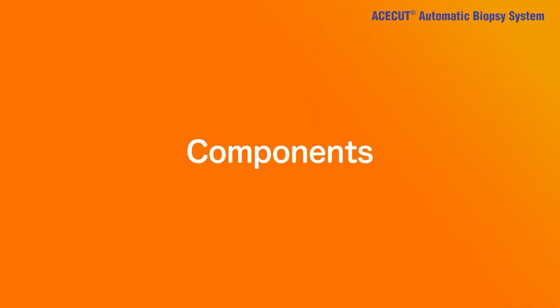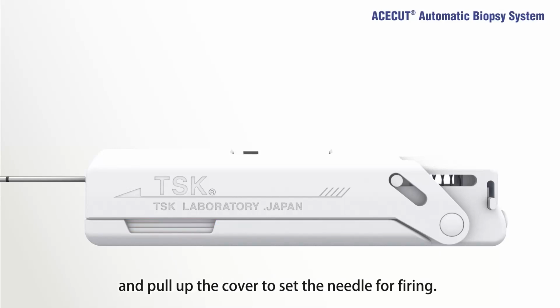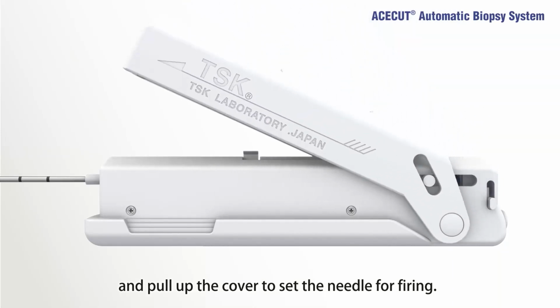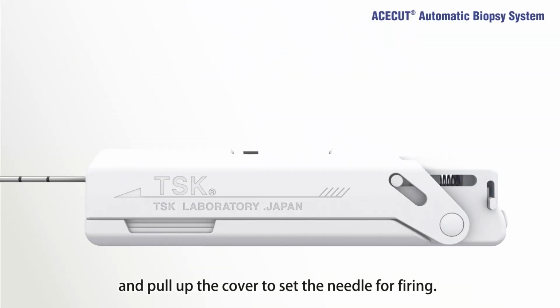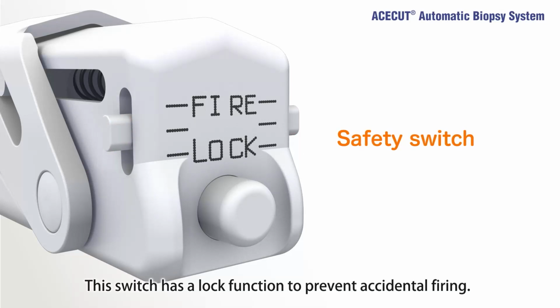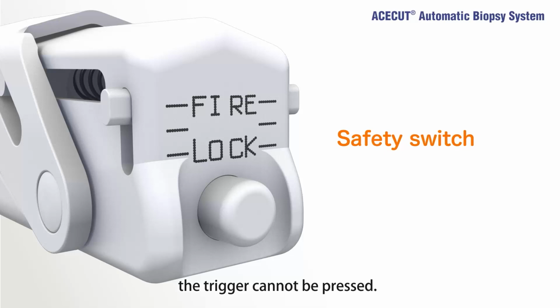Components: the main body. Hold the notches on the sides to pull up the cover to set the needle for firing. The safety switch. This switch has a lock function to prevent accidental firing. When the safety switch is in the lock position, the trigger cannot be pressed.